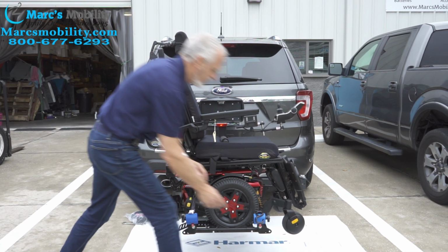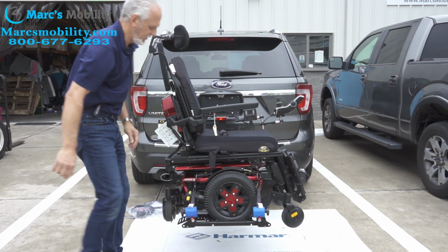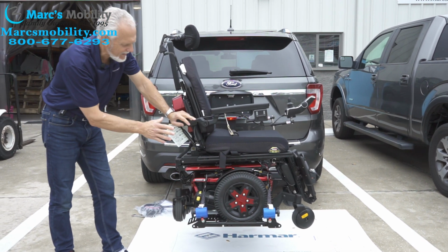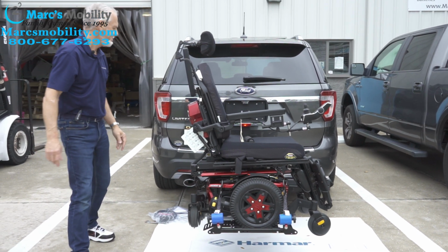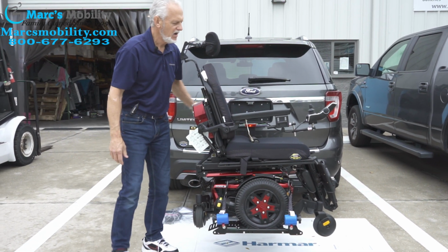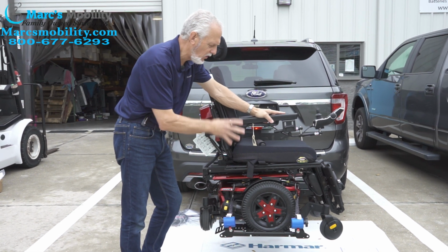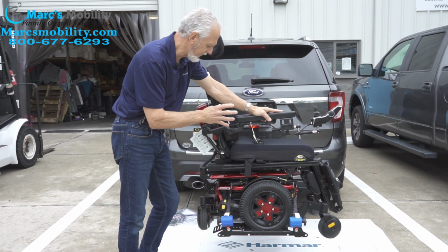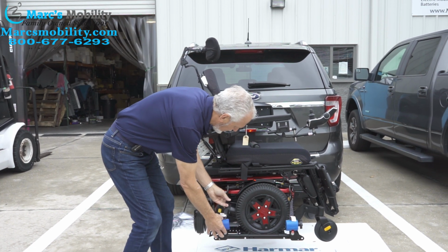That's how you're strapping the chair on. Then you tighten it up, okay? So these are your 4 straps holding the chair and the bar. Then you put your seat down. Always make sure you have a cover on these chairs. These are very expensive chairs. You do not want to go down the road without a cover. You have to have a cover, okay? So I'm going to take the chairs out, pull the straps out.